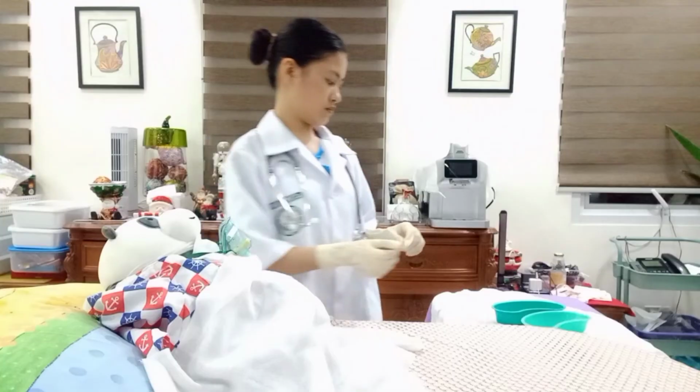Last, dispose of the used equipment in the appropriate biohazard receptacle according to agency policy. For the rationale, properly disposing of used equipment prevents cross-contamination.